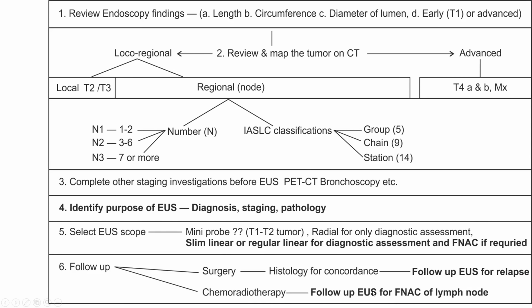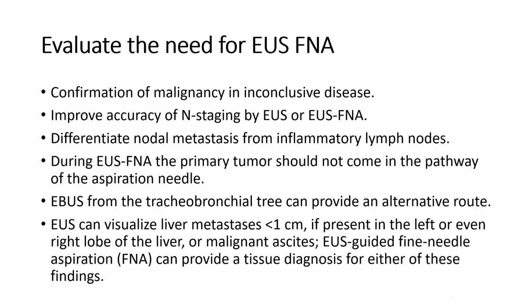So this is now the entire presentation of how I would be doing a staging of esophageal cancer. So when do we do FNA?